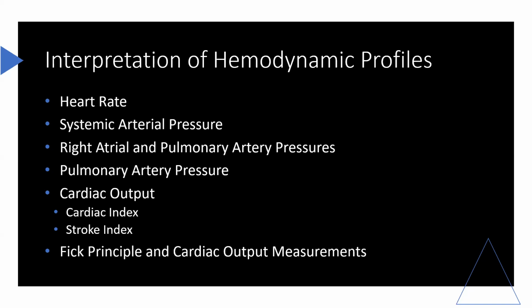The baseline of the PA pressure tracings shows characteristic respiratory fluctuations arising from changes in the intrathoracic pressure. With spontaneous breathing, the intrapleural pressure decreases during inspiration, causing the PA wave pattern to descend. Conversely, with spontaneous expiration, intrapleural pressure increases and the wave rises.